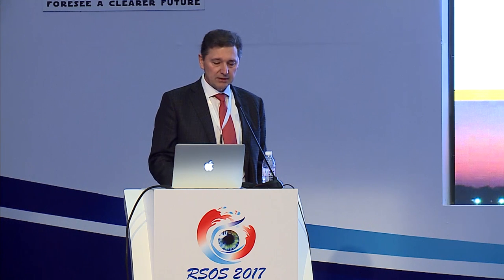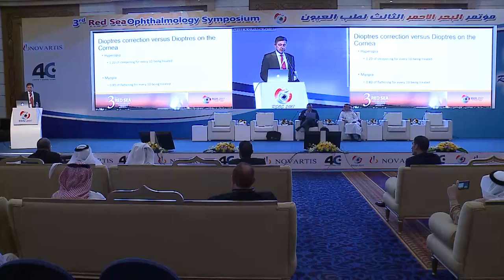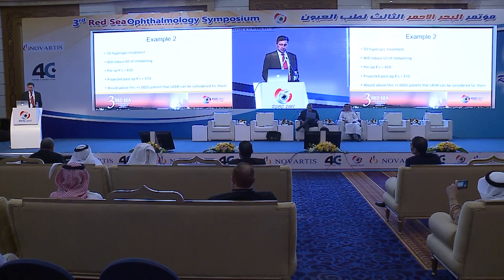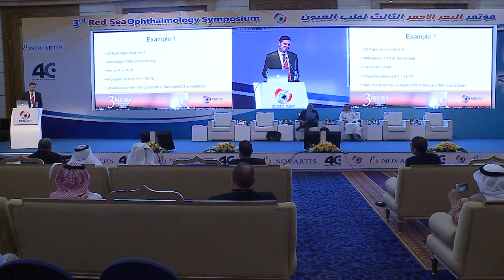So Mazen showed this a moment ago. Just bear in mind when you calculate the projection that for every one diopter of hyperopia, the cornea steepens by 1.2. And for myopia, it flattens by 0.8. So I'm going to show you an example. A 2-diopter treatment is going to induce 2.4 diopters of steepening. Pre-op K is 49. Projected post-op K is 51. Rather don't do it, even though the patient's only plus 2.